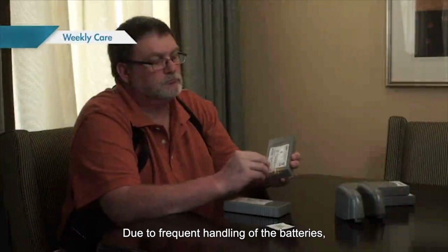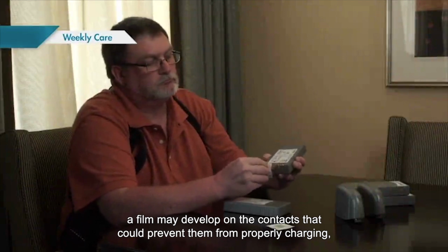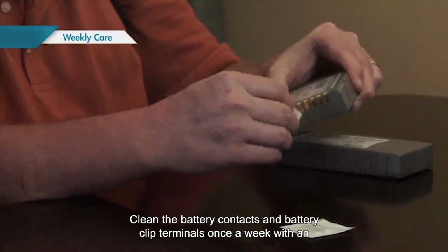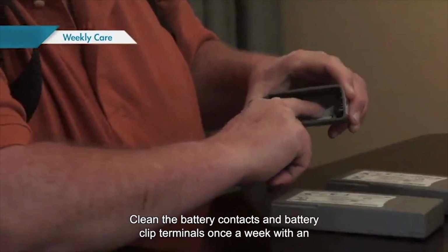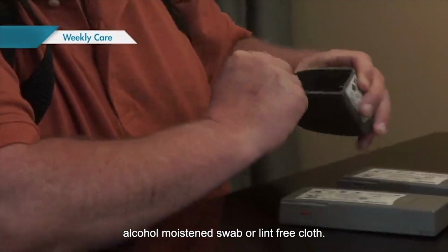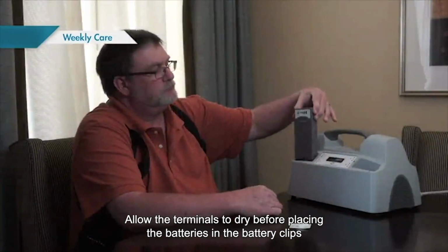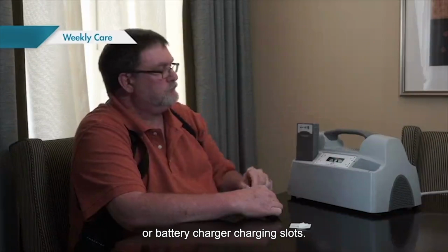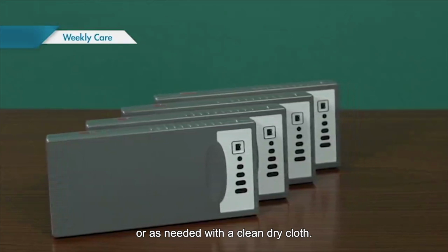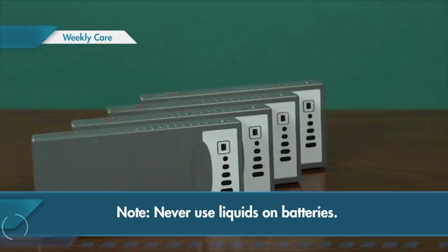Due to frequent handling of the batteries, a film may develop on the contacts that could prevent them from properly charging or working properly unless regularly cleaned. Clean the battery contacts and battery clip terminals once a week with an alcohol-moistened swab or lint-free cloth. Allow the terminals to dry before placing the batteries in the battery clips or battery charger charging slots. Also, clean the outside surfaces of the batteries periodically or as needed with a clean, dry cloth. Never use liquids on batteries.